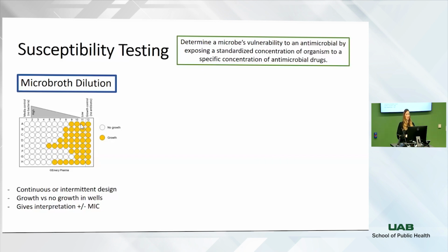So the interpretation is your SI or R value, and your MIC value would be like a value of 3. This means that an MIC of 3 micrograms per microliter or 3 micrograms per milliliter of antimicrobial was in the well that was effectively able to inhibit growth.